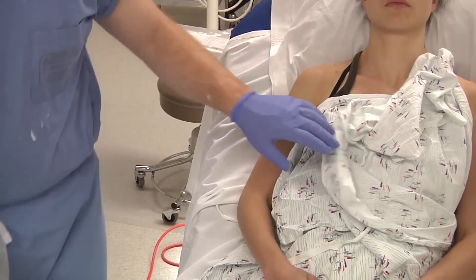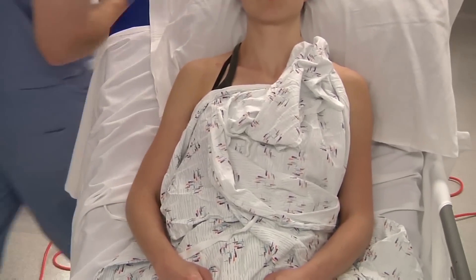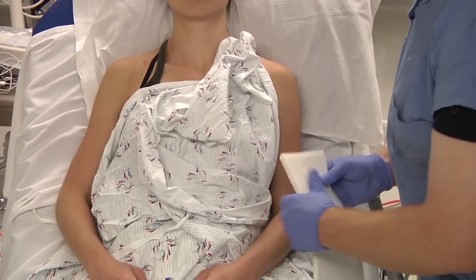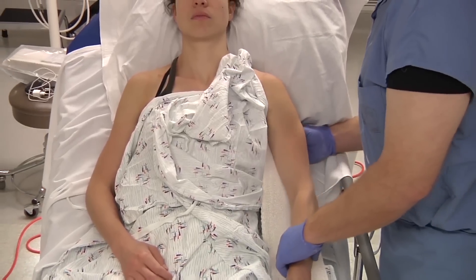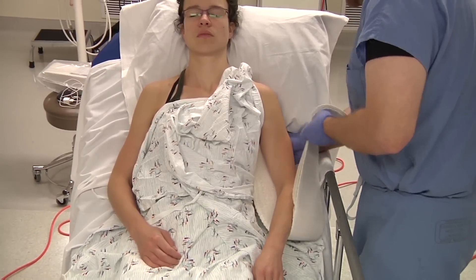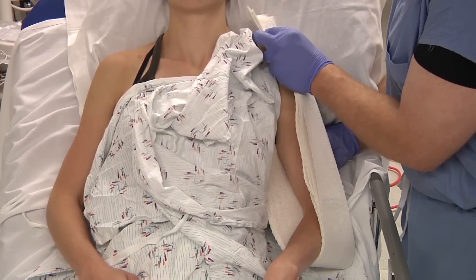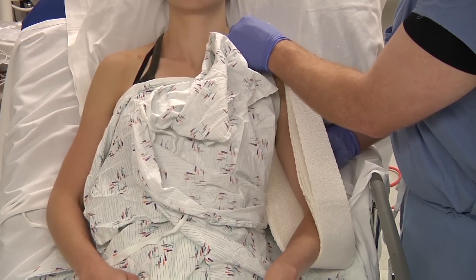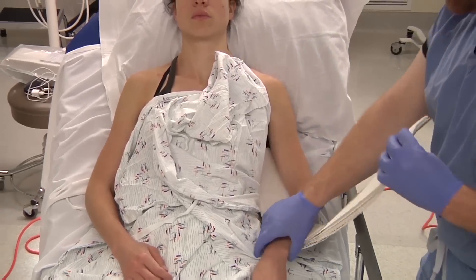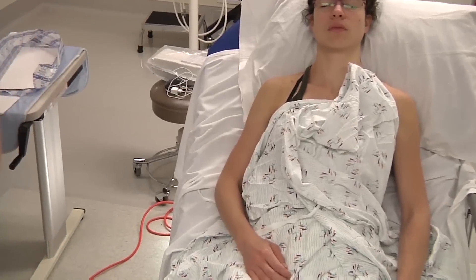First thing that we generally do is on the good arm, we take our plaster or another measuring device and measure where our splint is going to go. Pretty much as high as you can in the axilla, three finger breadths down. The splint generally wraps around the arm and will come up to the neck. You can always trim it back, so this is about the appropriate length.